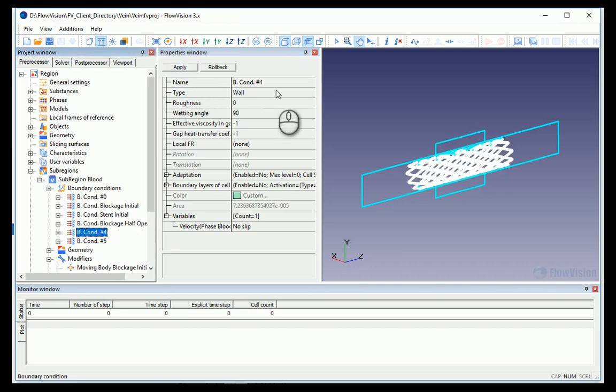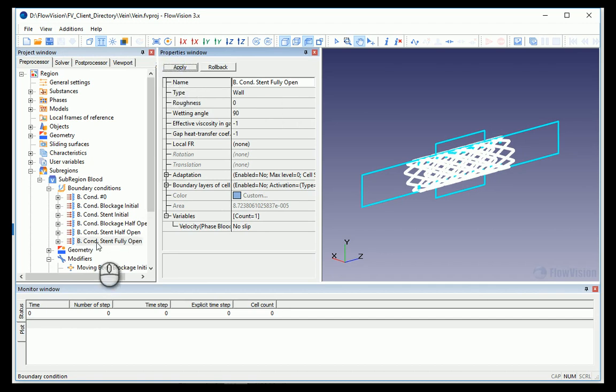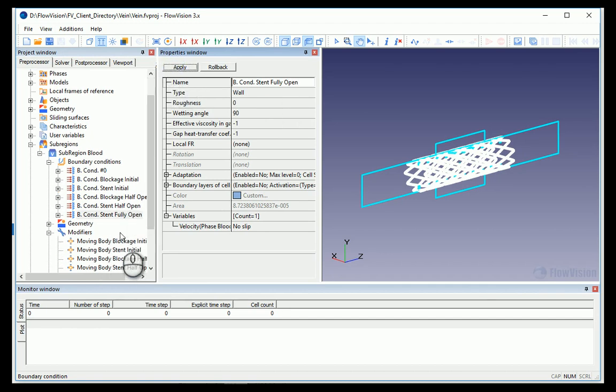You don't have to give names for all of those, but assuming you will use more than 5 bodies, I would highly recommend you to give names in order to avoid confusion during the project.